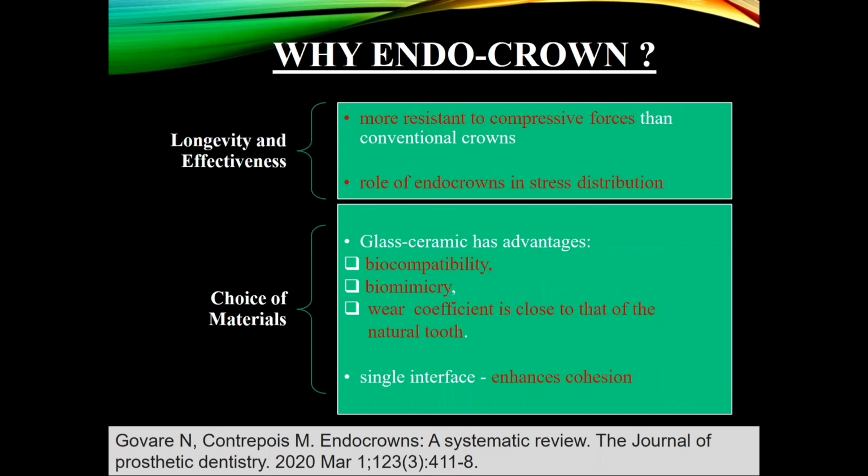So finally, why do we choose an endo-crown? Because of two basic factors, that is the longevity and effectiveness of it, and the choice of materials which is used to fabricate it. So there are several studies which concluded that endo-crowns were more resistant to compressive forces than conventional crowns. And more recently, finite element analysis highlighted the role of endo-crowns in stress distribution.